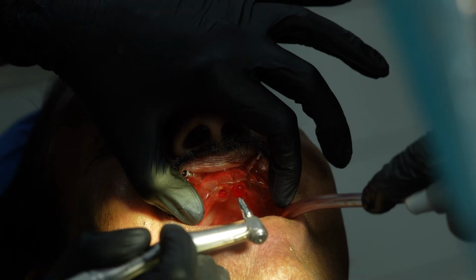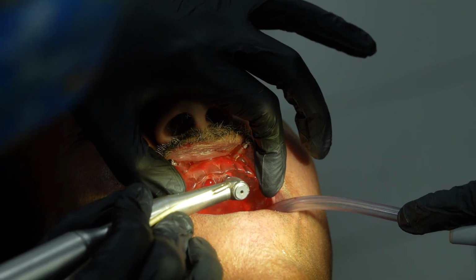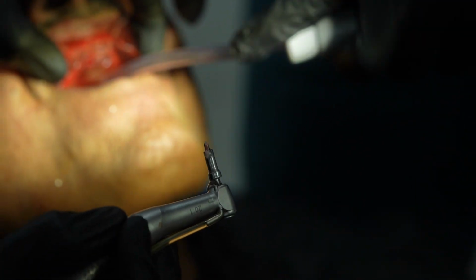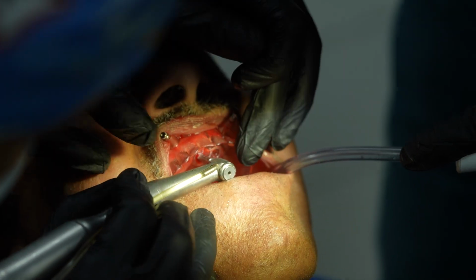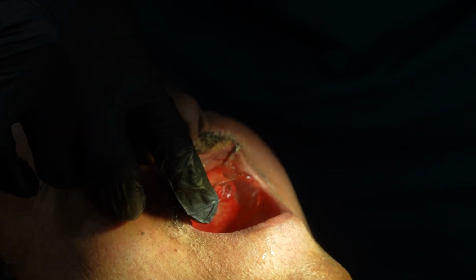Flattening drill which I had shown to you. Make sure it reaches to the crest. You can see the bone spicules. So now think on the bone level. Flattening has been done.